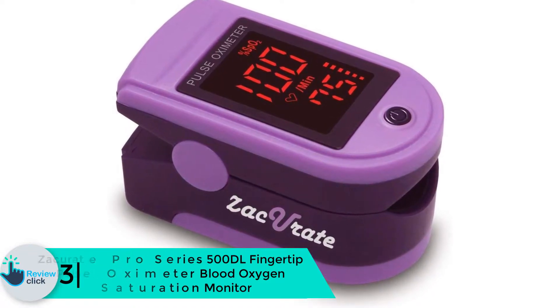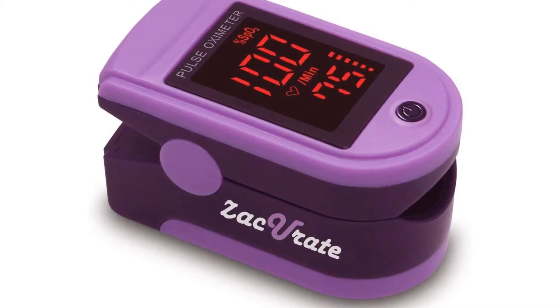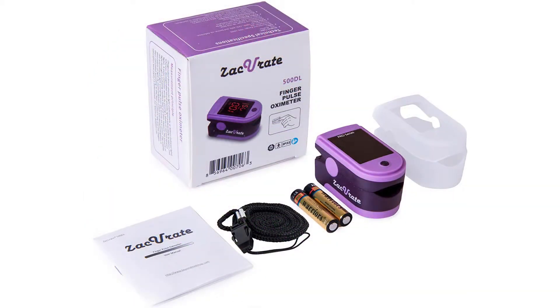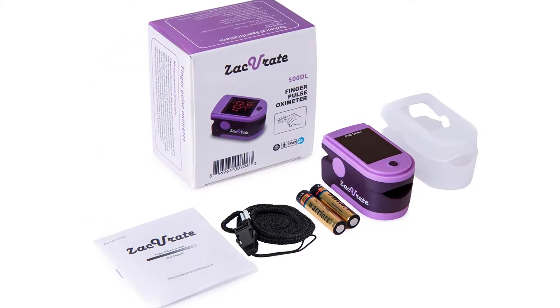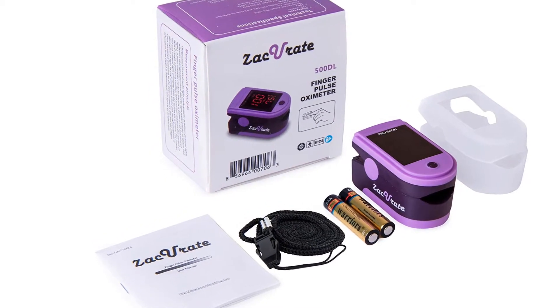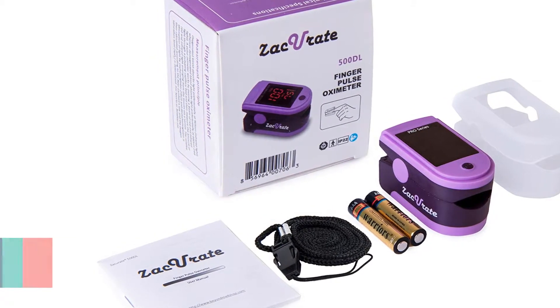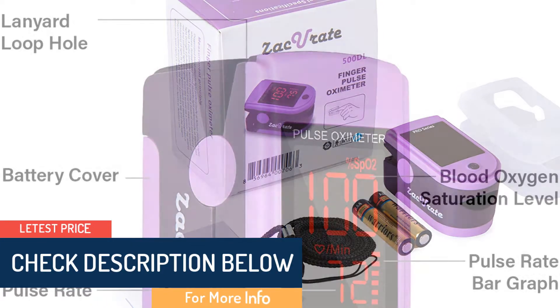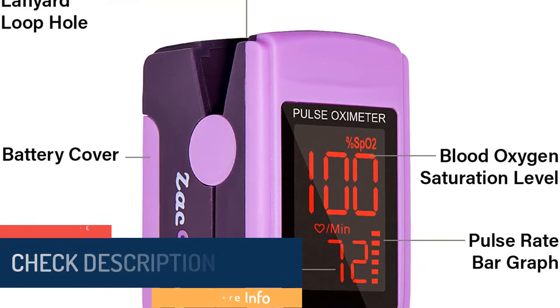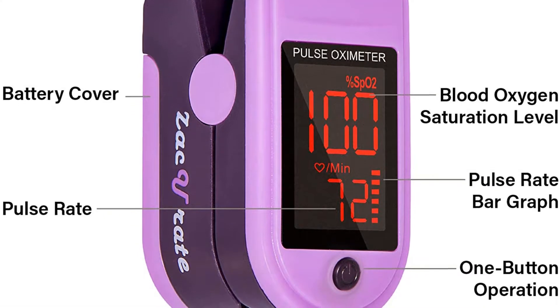At number 3 we have the Zaccurate Pro Series 500 DL Fingertip Pulse Oximeter Blood Oxygen Saturation Monitor. Making guesses about a person with low oxygen concentration isn't reliable — you need to invest in a good oximeter. This Pro Series 500 DL by Zaccurate is the solution. Made with the latest technology for high accuracy, the device measures pulse rate and SpO2 level in less than 10 seconds, making it great for athletes, hikers, and anyone wanting to measure their blood oxygen levels.